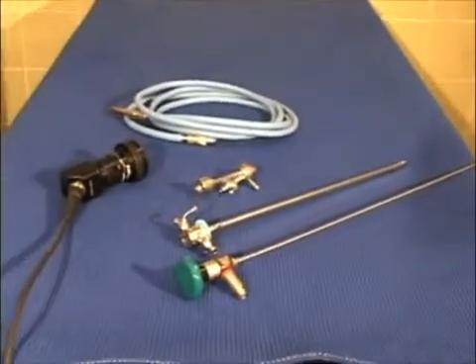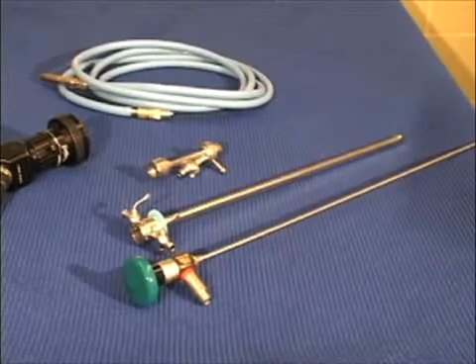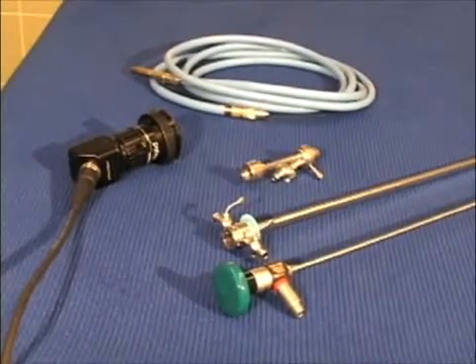The vaginoscope consists of three working parts: the fiber optic telescope, the protective sheath with working channels, and the bridge with ports.